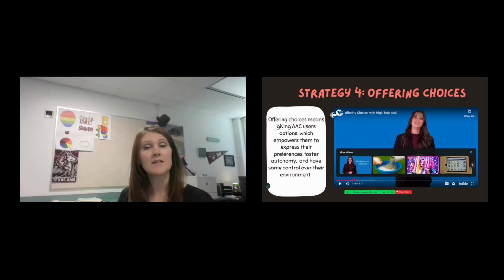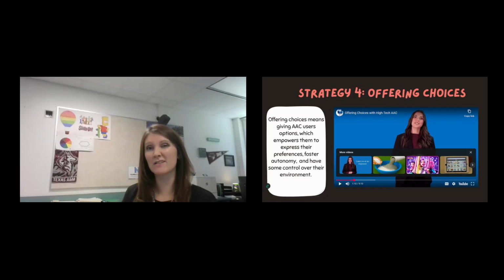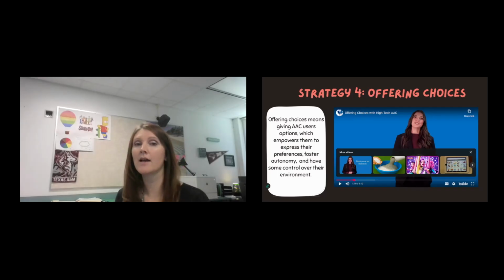So that's where we'll stop on this video. You'll see that the strategies build upon each other. So thinking about expansion, she's saying if the student reaches for something as a way to make a choice, you can then attribute meaning to that, expand that gesture to a word, and model want because you want that. Or maybe you gave them a choice of snack and you can model that fringe vocabulary. Oh, it looks like you chose fruit snacks, and model that on the device.